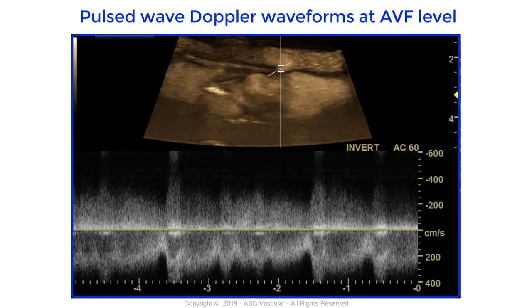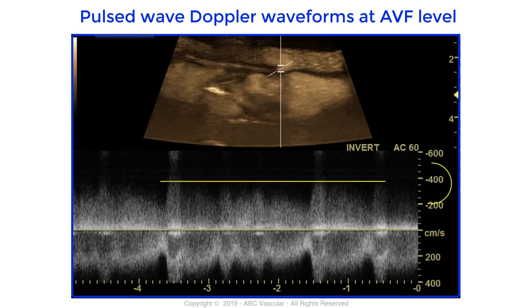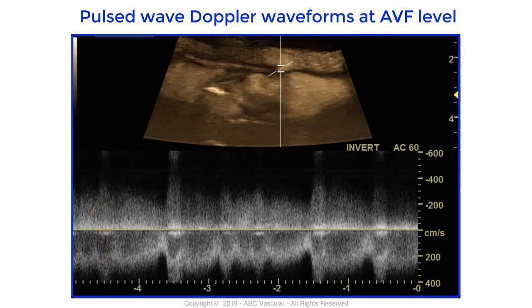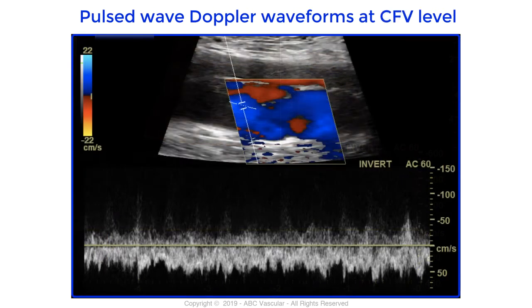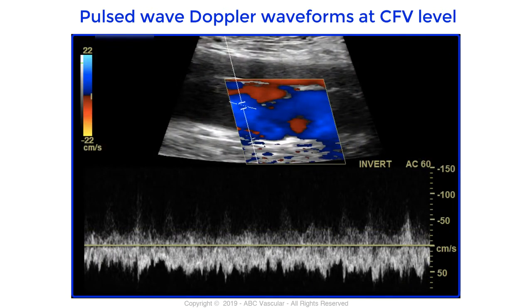The pulse wave Doppler demonstrates high blood flow velocity. bidirectional flow. The sample is taken at the level of the common femoral vein, which appears arterialized and non-phasic, as is typical of veins affected by an arteriovenous fistula.